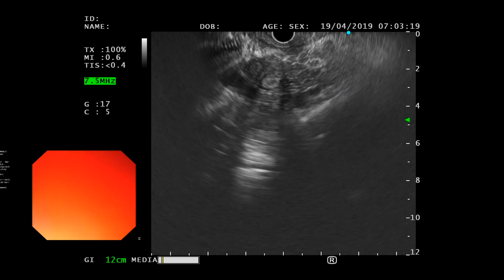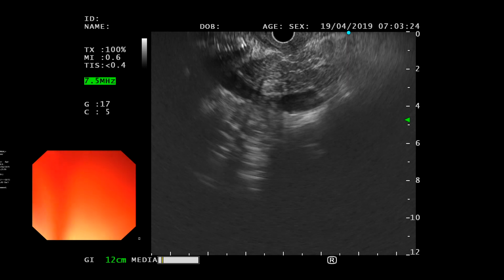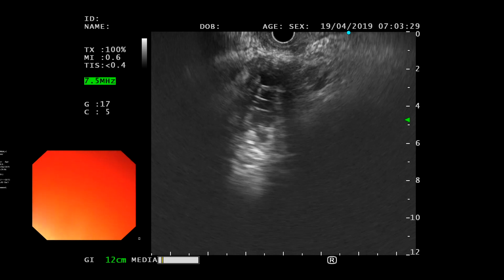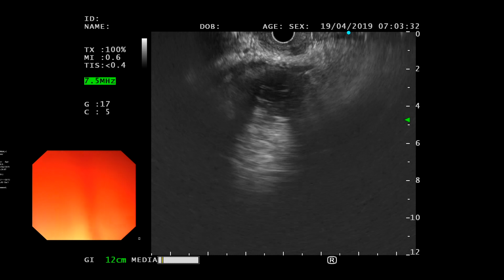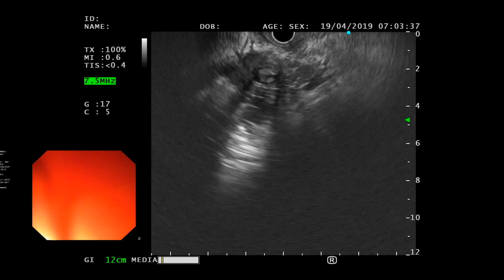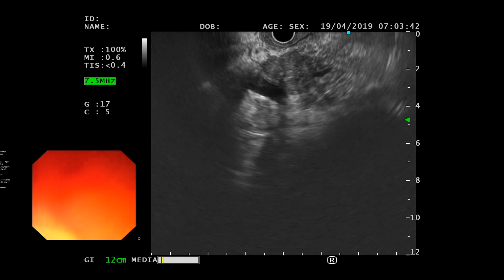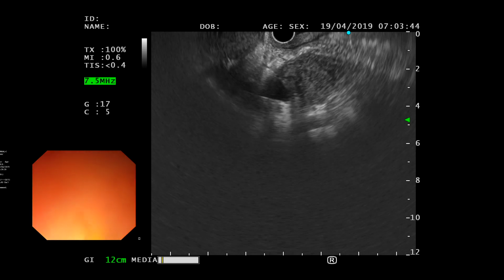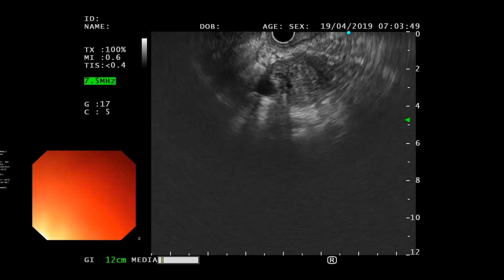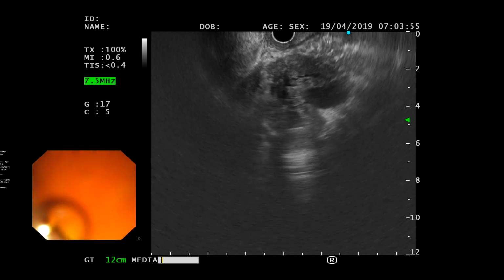अच्छा हाँ, ये अब आप अभी तक हाइलम ऑफ लिवर की साइड पे नहीं गए. इसको आप हल्का सा पुश करो. और व्हील है क्या? नहीं, दिखाओ. जैसे आपने पहले बहुत अच्छा दिखाया था मुझे, CBD दिखाई थी लॉन्ग विद स्टेंट. ये ना, हल्का सा आपने पुश किया, डाउन किया, और ये लाइक दिस. Now you're going towards the hilum of the liver. ये लिवर, this is the hilum, this is your mass. ठीक है, this is your mass.